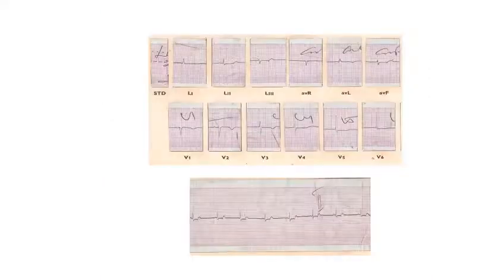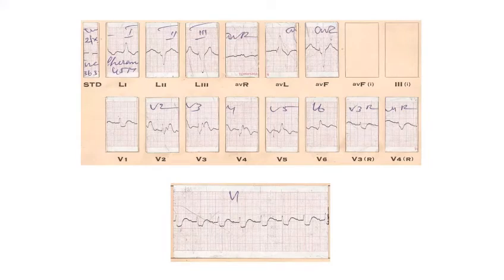Sir, in type 3 long QT syndrome also, mainly the ST segment is prolonged, not the T wave. In QT prolongation, you can get ST segment prolongation, definitely. But I wanted to impress upon you that sometimes ST segment prolongation may be one important electrocardiographic abnormality, and QT prolongation may not be too much. So when ST prolongation is significant, more than 100, 150, 200, then the conditions that you should suspect are hypocalcemia and ischemia.